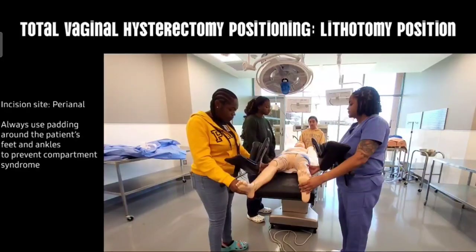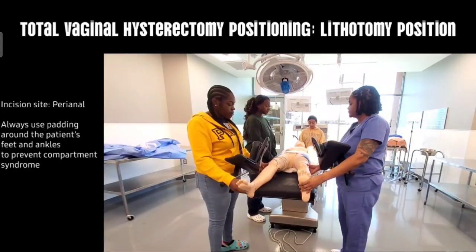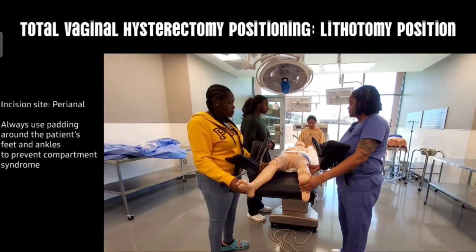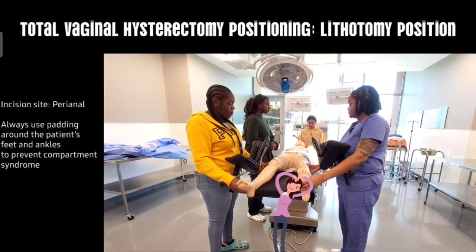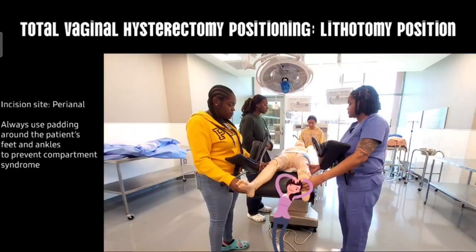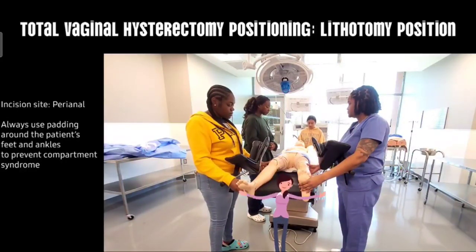Positioning of this patient who is undergoing total vaginal hysterectomy. So positioning a patient for surgery typically occurs after anesthesia has been administered. The primary goal is to ensure optimal access and visibility of the surgical site while maintaining the patient and staff safety. Additionally, proper positioning should allow easy access for administration during IV fluids and anesthesia.